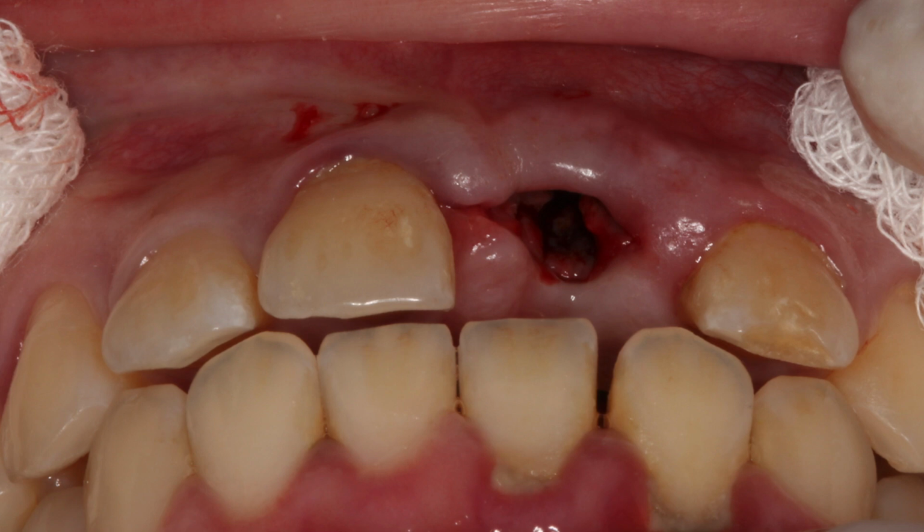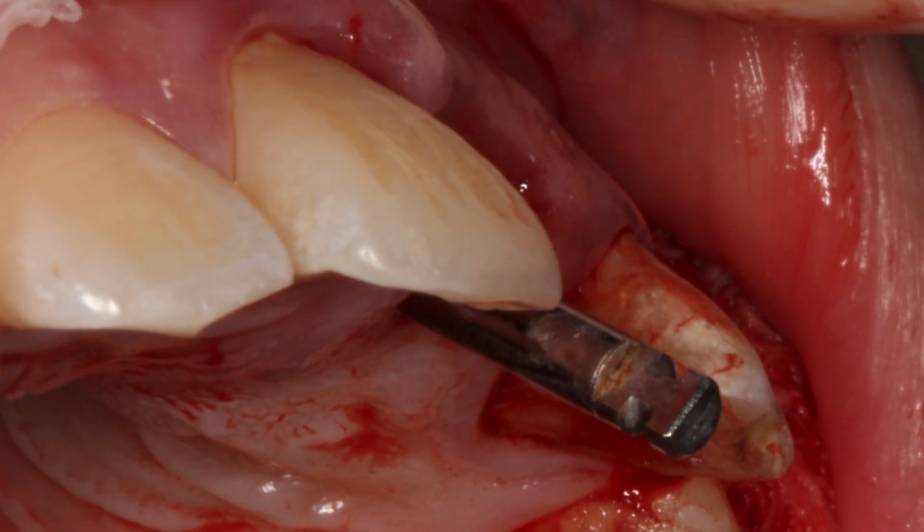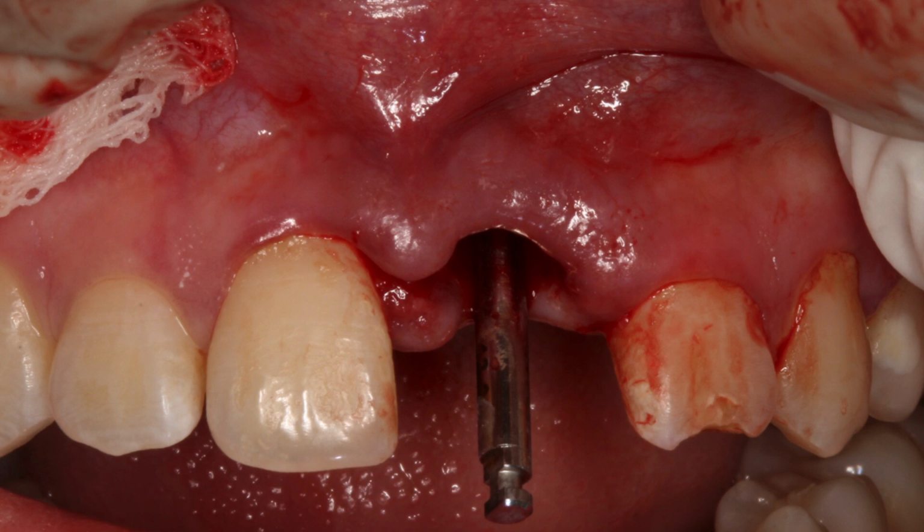So the first thing we had to do is debride the socket, and then we are going to start the osteotomy very carefully, looking at all the anatomical parameters very carefully. And this was our final position of the osteotomy that we all agreed was fair. From a mesial distal point of view, this is simple. It needs to be simply in the center.